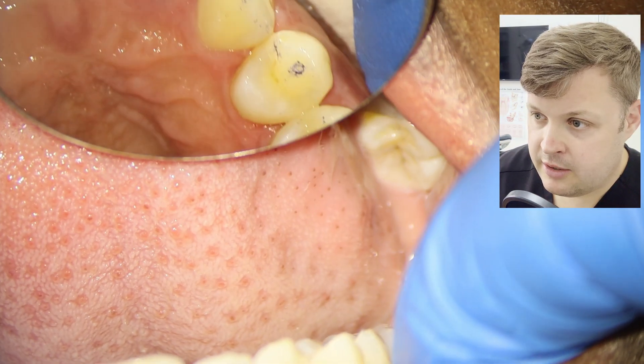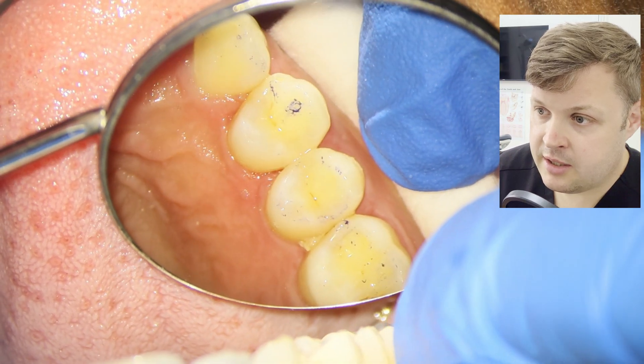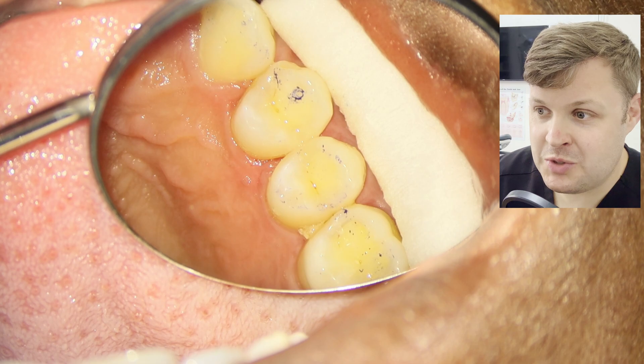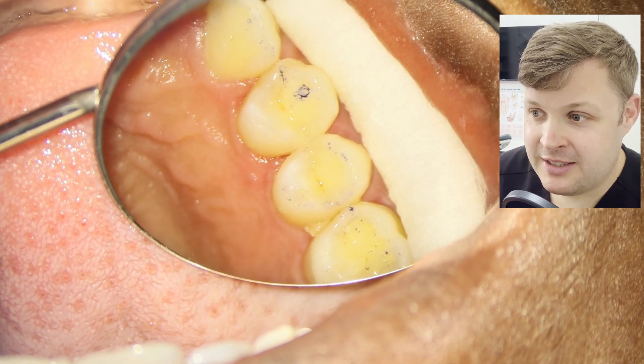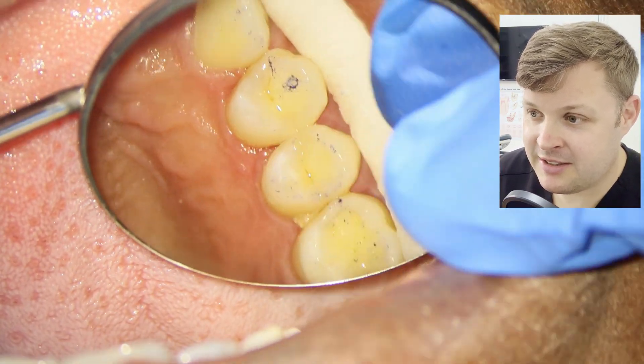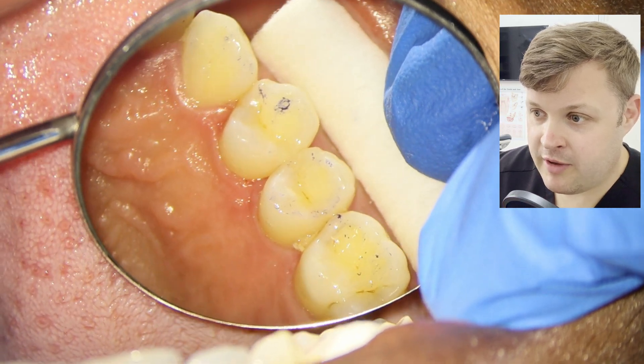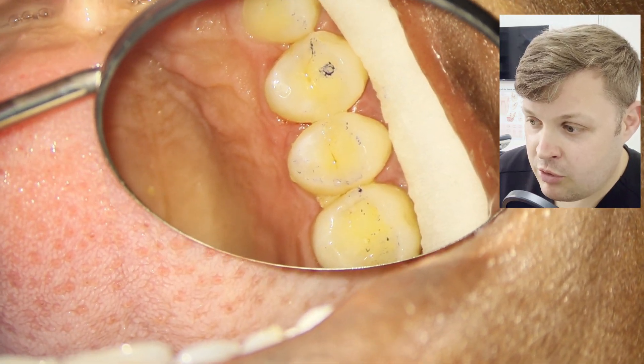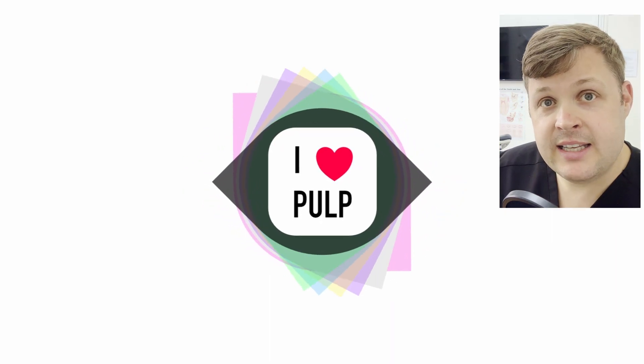The patient is really happy. A great thing about using the microscope is we can show the pictures to the patient on the big screen so they can see all our hard work, and people really like to see that. Overall, really nice results.